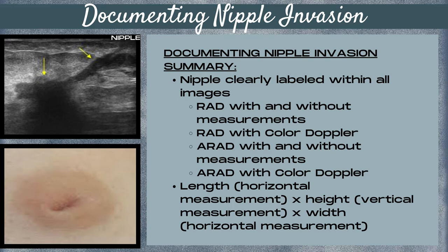It doesn't matter which dimension you take your measurements in — you just want to ensure that you have three dimensions in total: your length, which is a horizontal measurement; your height, which is a vertical measurement; and your width, which is a horizontal measurement. When measuring the mass, any angular or lobulated margins should be included in the measurement, and if there's a thick echogenic halo present, that should also be included.